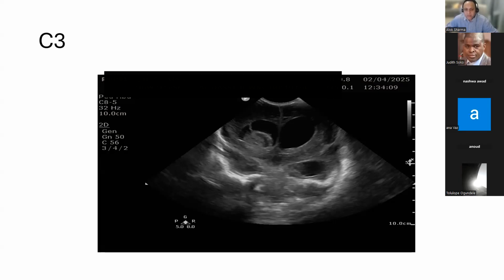Again, you've got a beautiful image in the midline. Both lateral ventricles are dilated. Here, the clot seems pretty much to be intraventricular, and these are temporal horns that are dilated. And you're just getting a small view of the third ventricle coming in there. So it's a very good image. There's also, for those of you who have a sharp eye, midline shift. You can see that the interhemispheric fissure is pushed to the opposite side. So carry on. Very nice image.